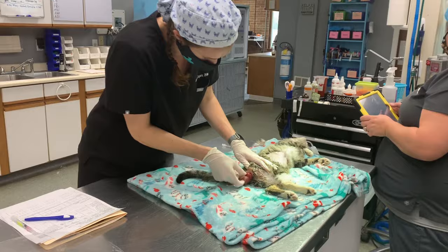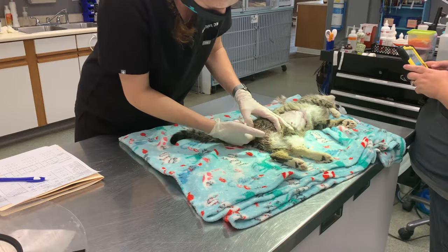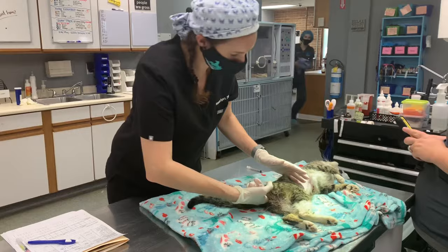So we've got her prepped for her spay. I'm going to see if I can gently get this in here now. There we go — it pushed in there pretty nicely. Sugar is your friend. Now that it's in there, that will feel much better and that swelling will start to go down.